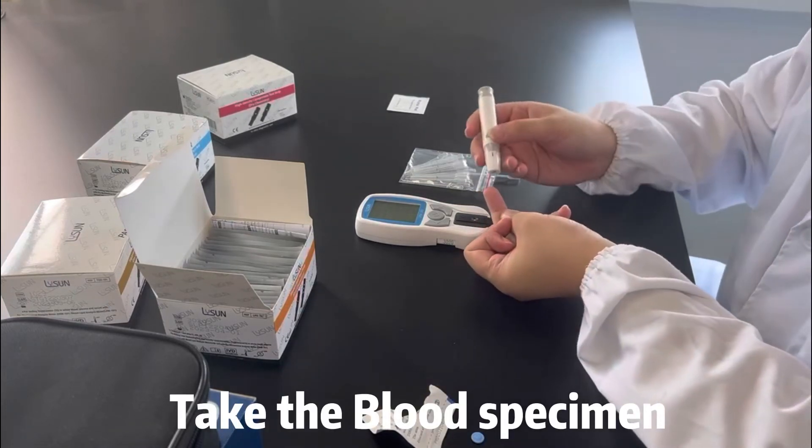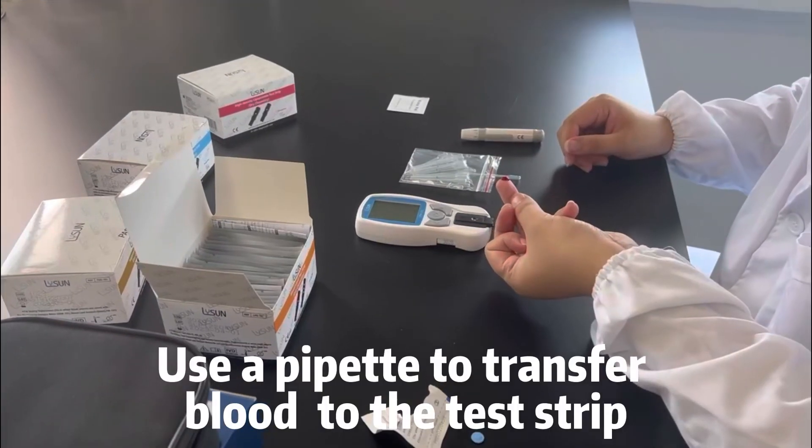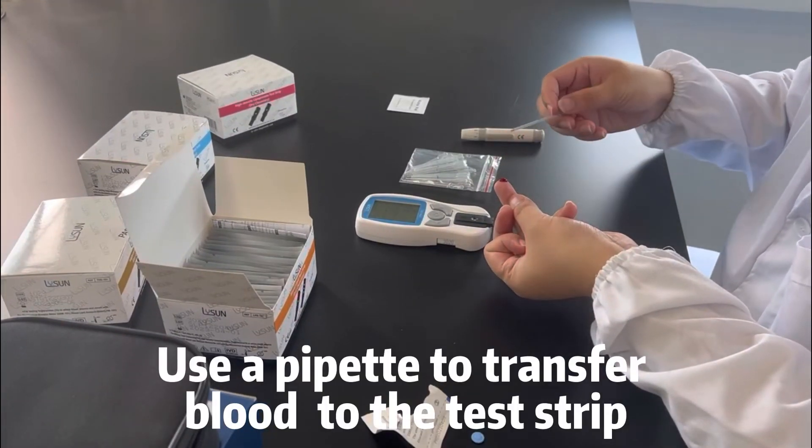Take the blood specimen. Use a pipette to transfer blood to the test strip.